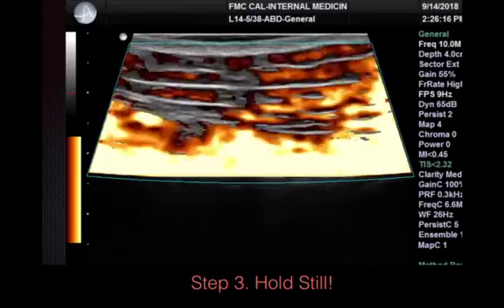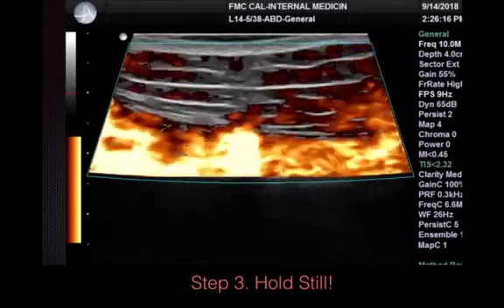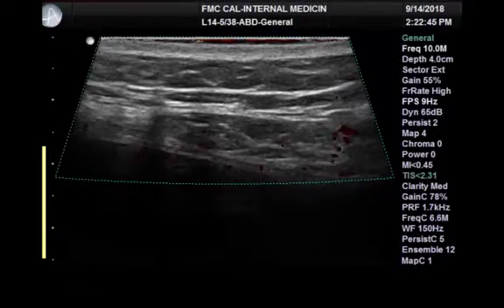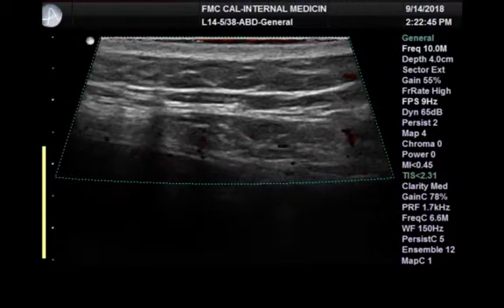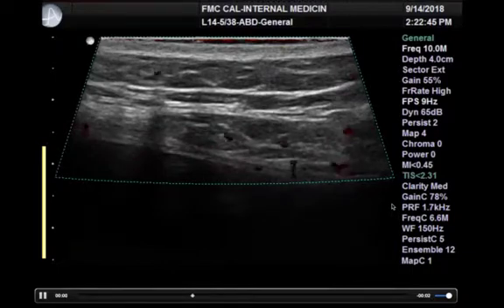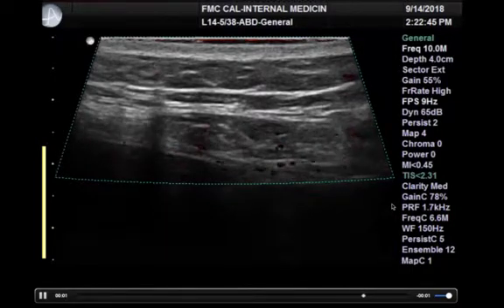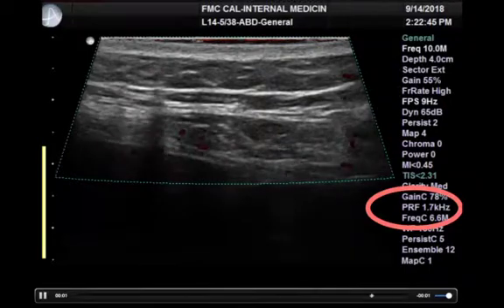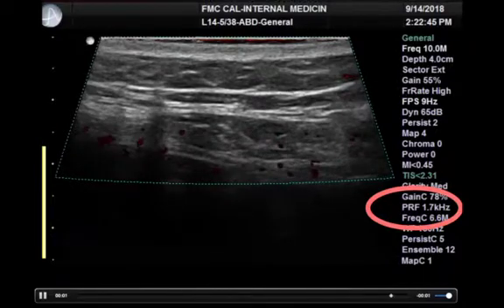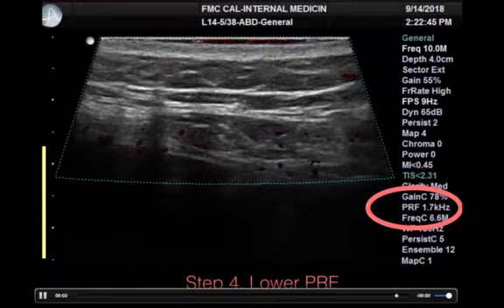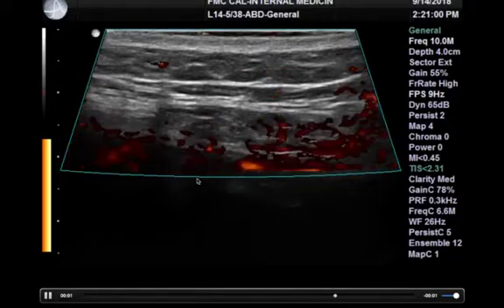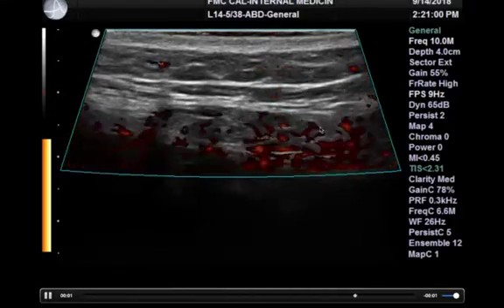Step three is to hold still. As I indicated, any movement is going to make the whole screen flash with artifacts. Once you hold still, there are a few more steps. It may look like there's no clear vasculature, but it could be that the pulse repetition frequency, or PRF, is set incorrectly. All you need to know is that high PRF detects high flow and low PRF detects low flow. Right now it's set at 1.7 kilohertz, so step four is to lower it — here I have PRF set at the lowest, which is 0.3 — and you can see that a lot more things are lighting up because of movement, which allows me to detect any potential vasculature.